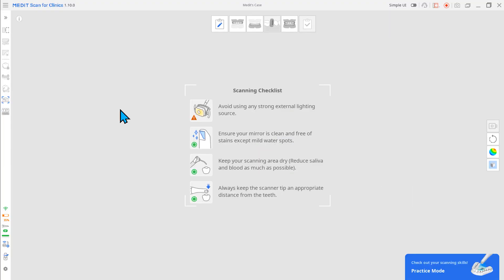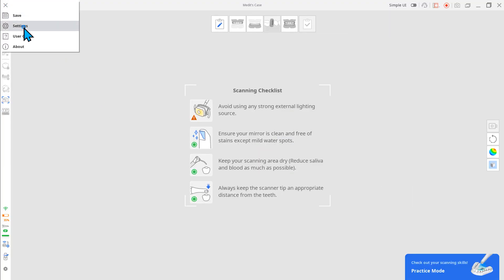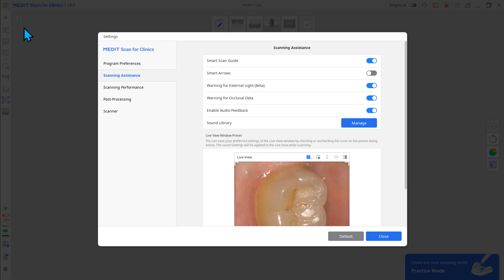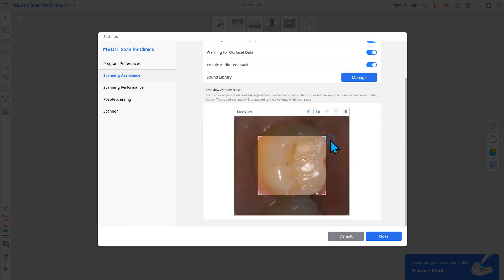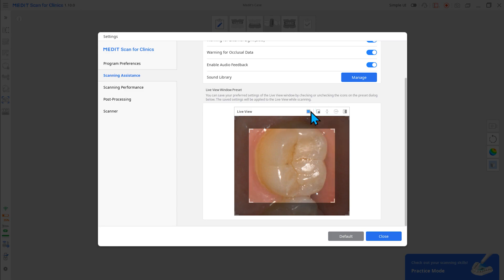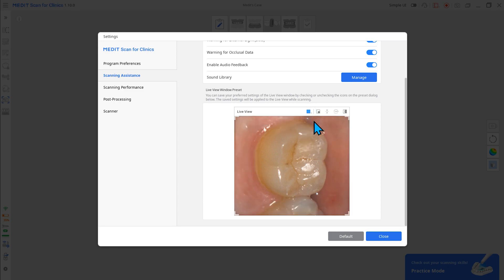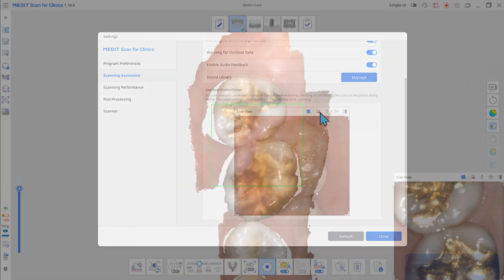And finally, users are now able to preset live view options. Go to Settings, Scanning Assistance, and change any available live view window options. Your changes will be applied once you start scanning again.